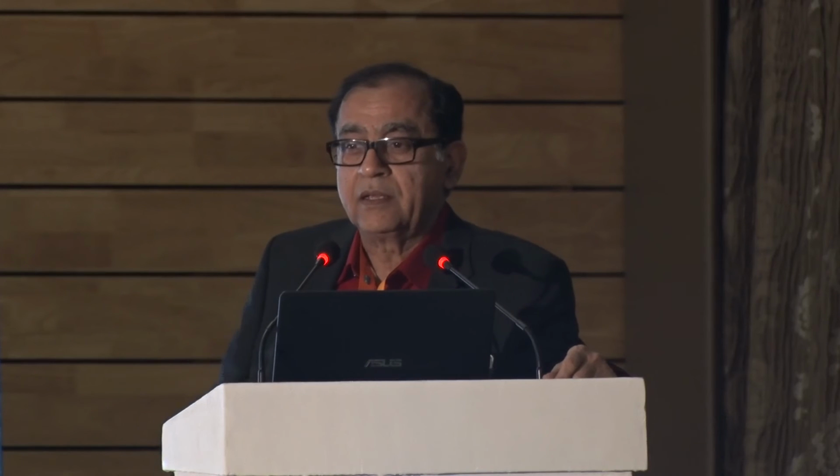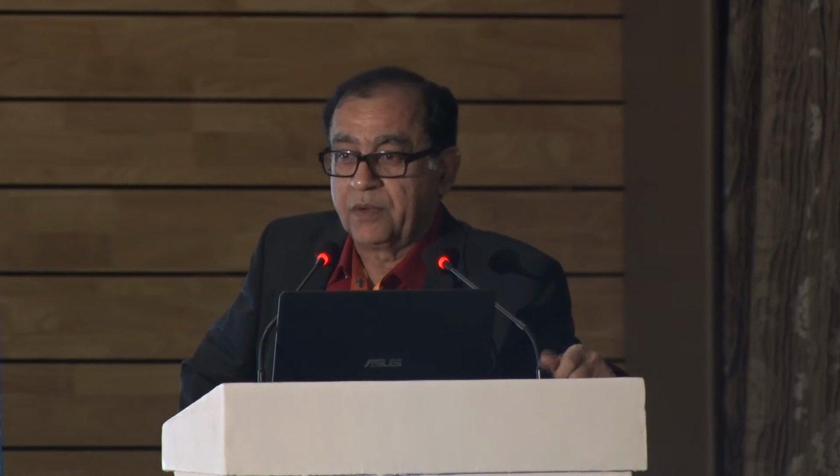And lasered the break area. And this patient had a very tight orbit. And in fact, the assistant was feeling a little reluctant to give the block. She wanted to call me, but by that time I had gone for washing up, so she thought that she'll go ahead.